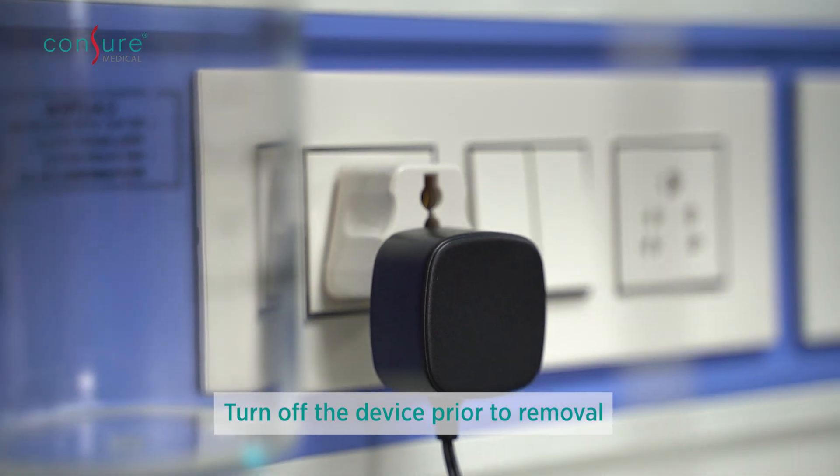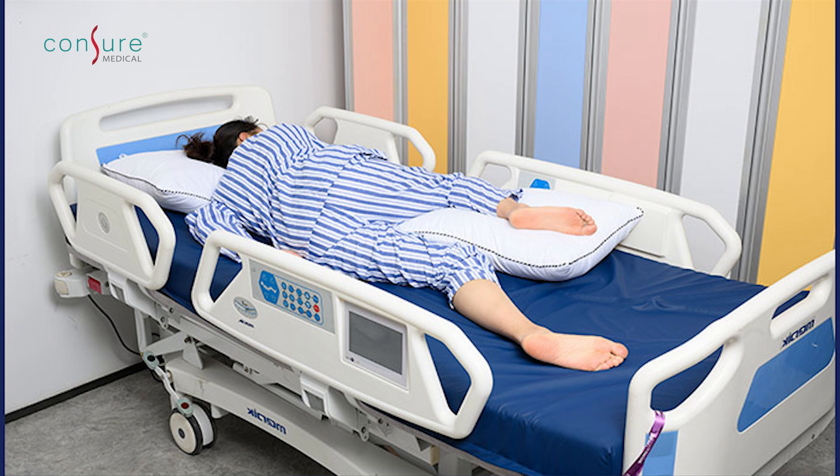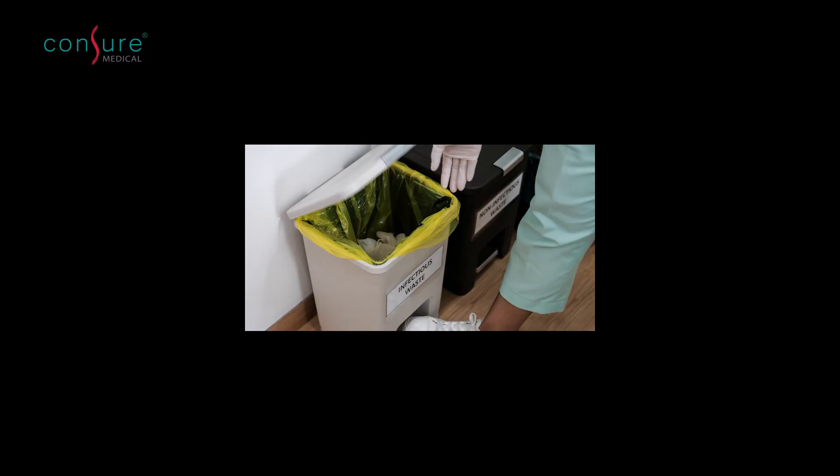Turn off the device by disconnecting the adapter from the Matic Hub and power socket. Position the patient in left lateral SIMS position. Slowly retrieve the receptacle from the anal orifice. Discard the device along with the power adapter according to institutional protocol.